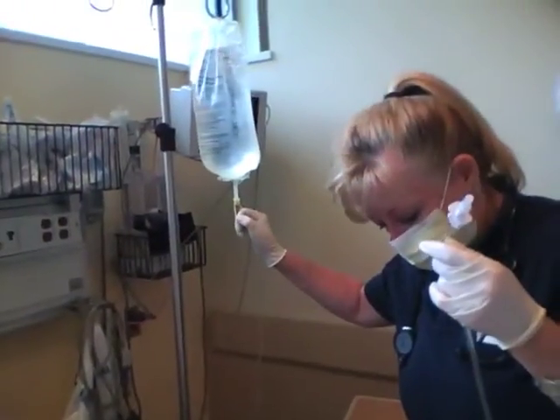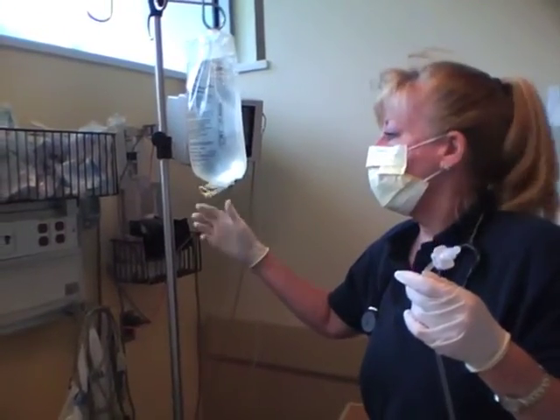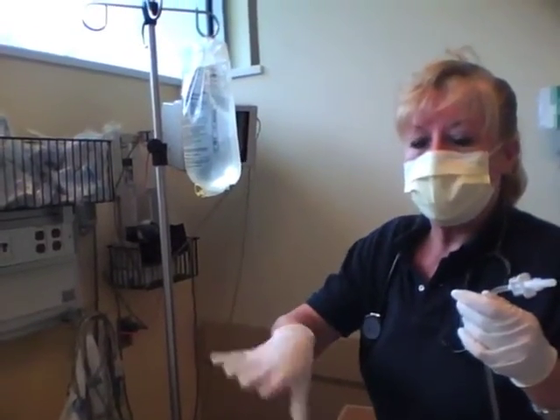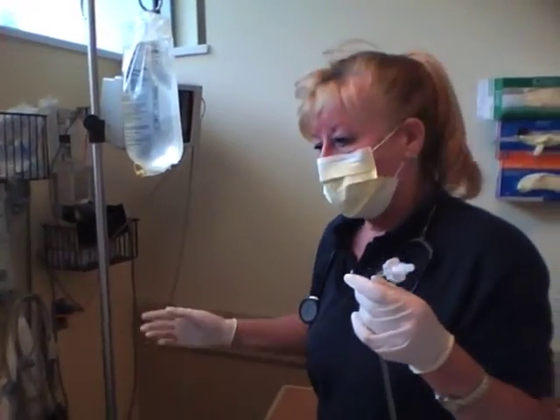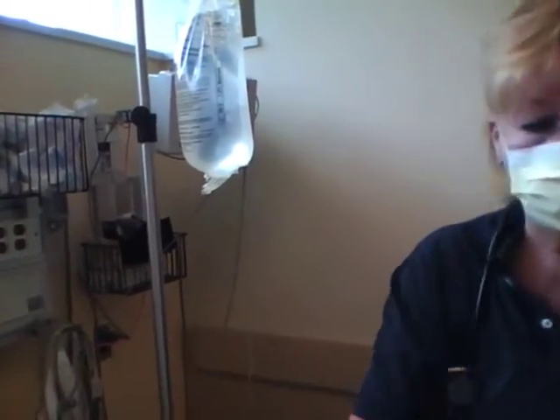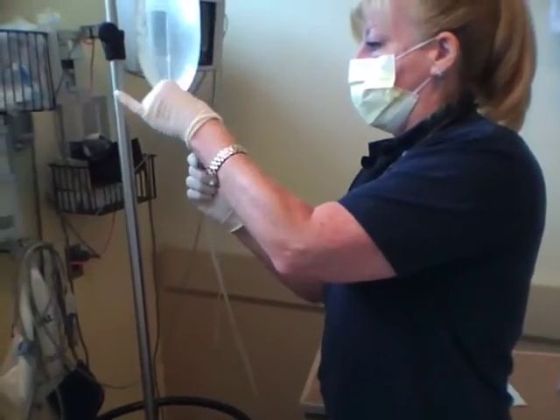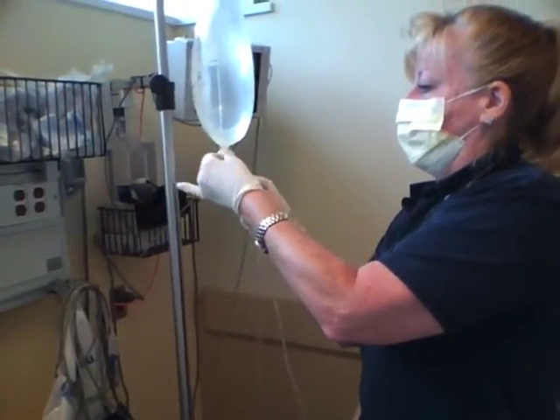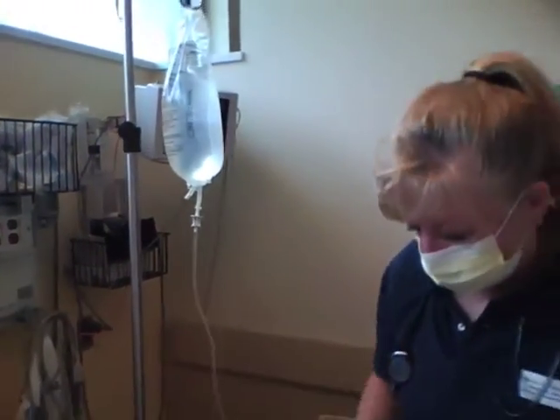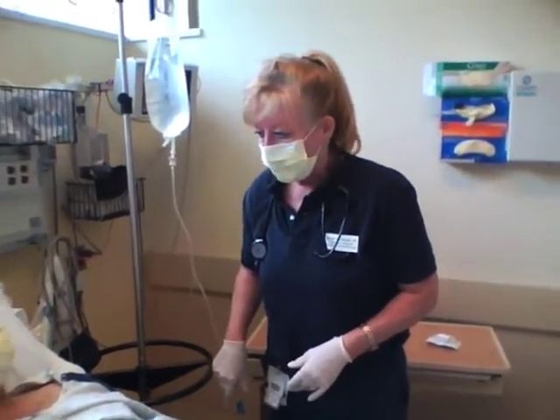So if we determine that he doesn't have any effluent to drain, we may have to put some dianeal in, let it dwell for a little bit, and then drain it to be able to do a culture. So I'm going to expose my female connection, and then my male connection — I'm going to thoroughly spike my bag. And I'm not going to put it in for a dwell until I ask the physician what they want to do.